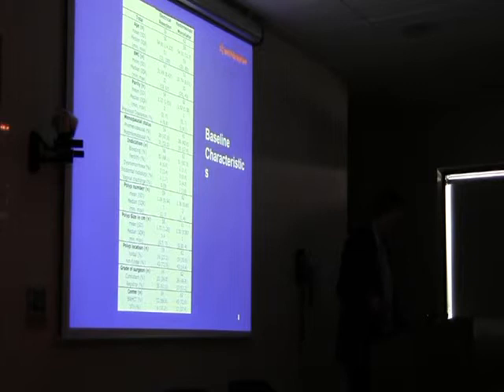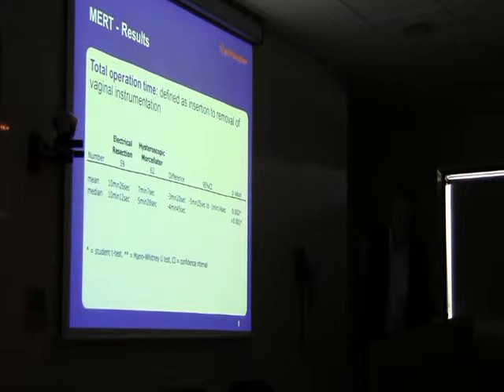We looked at fundal polyps and non-fundal polyps, but again they were balanced between the groups. So, just the main headlines then. Treatment time, again, this is in the office, so this is important, as we've seen earlier with the ablations. The median treatment time is 10 minutes 12 seconds with the VersaPoint versus 5 minutes 28 seconds. They're both short procedures, but in the office, in the lithotomy position, obviously the shorter the procedure the better, I think you'd agree.